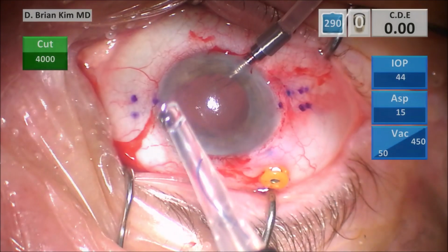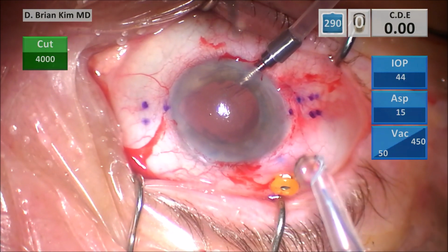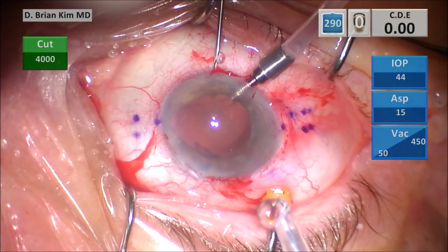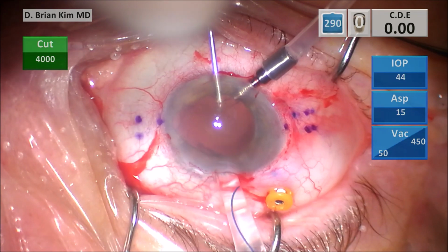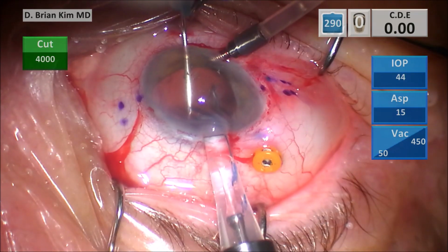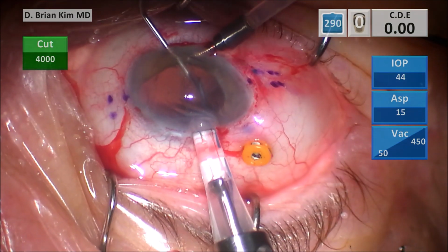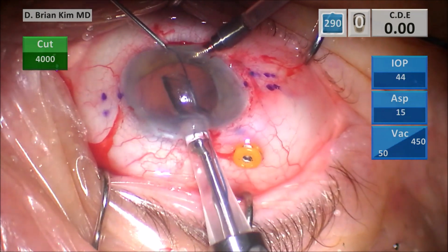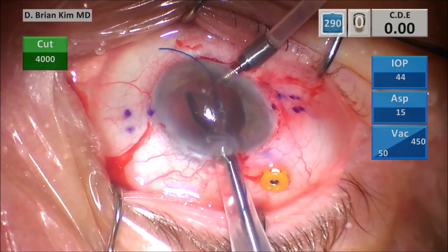And I'm pushing and advancing the lens here. I'm going to place my 25 gauge needle, which is again contra-incisional to my main 3 millimeter incision. I'm placing the injector bevel down, turning it towards the left. As my technician advances the lens, the haptic is coming out, and I'm docking it on the bevel of the needle. You can see I'm rotating the needle slightly so it's going to come out nice and flat, and then it goes out of the eye very nicely.